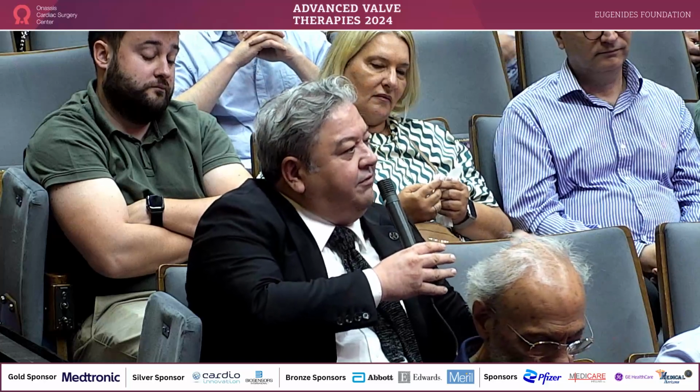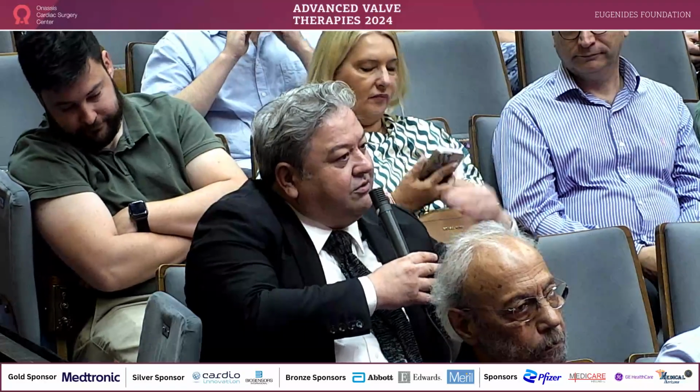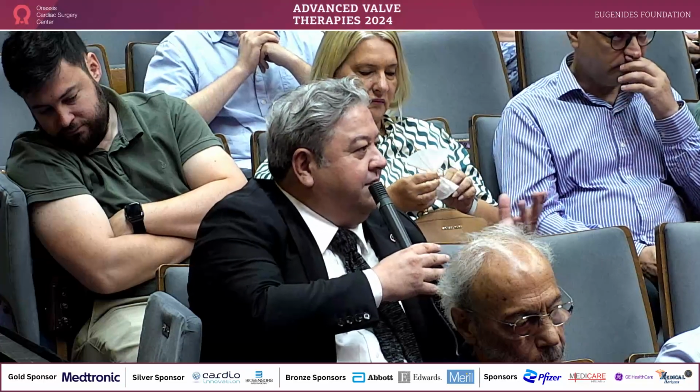With MAC, for this case, really, I think you made a lot of effort and thought about the balloon size, etc. Maybe it will be a concept. But if we inflate the balloon in the anterior mitral leaflet, if we cannot predict the tear which goes to the aortomitral curtain, that will be catastrophic. Batman, for me, is very safe in patients with complete ring. But for the MAC, I think it's the first case maybe, and we must think about it.